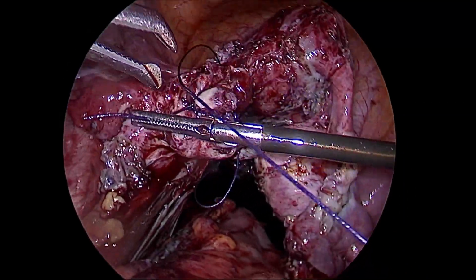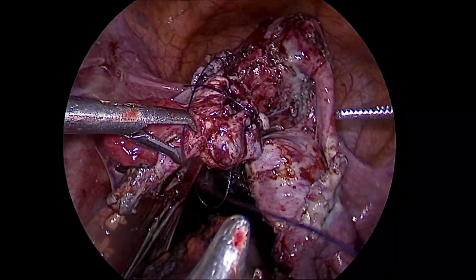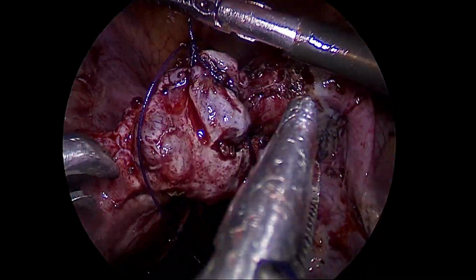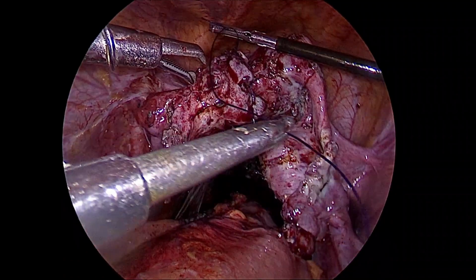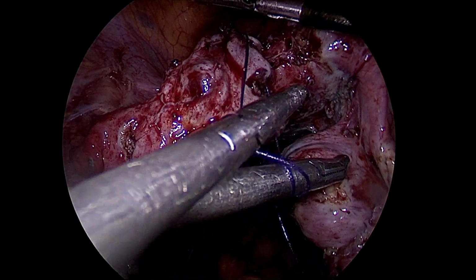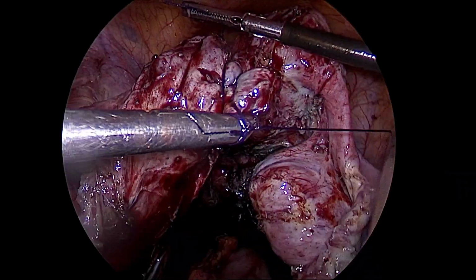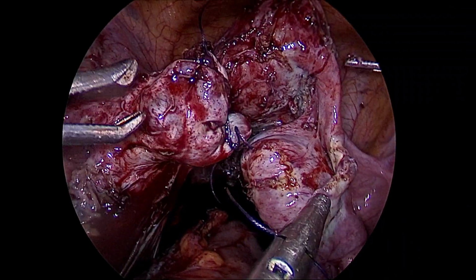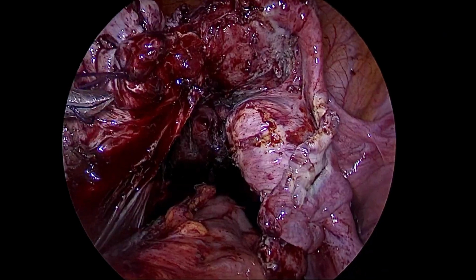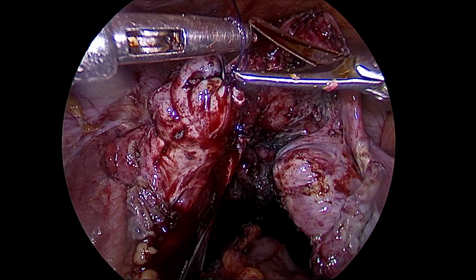There now we are taking the final few stitches on the ovary and approximating the surface of the ovary to ensure that it heals up very nicely. It can be a bit tricky to suture this ovary because it is cut in various places because of endometriosis. So this is where the suturing skill comes into use, and if you've done it well, once you scan this ovary after 3 months, you will find that there are actually follicles and it looks like a proper ovary on ultrasound.